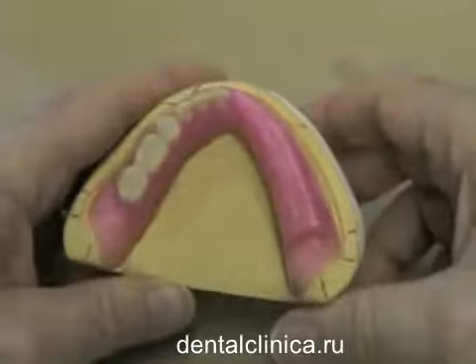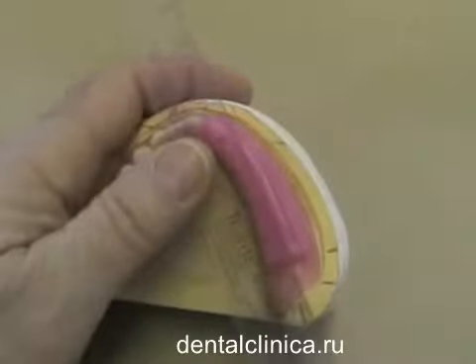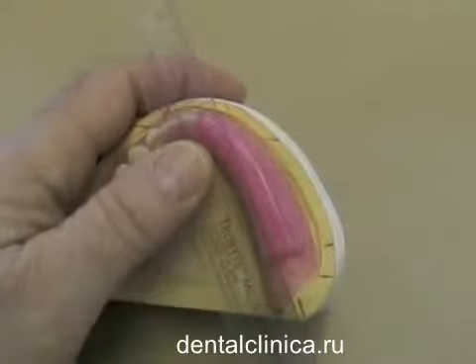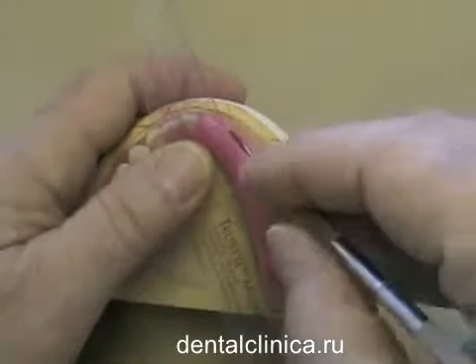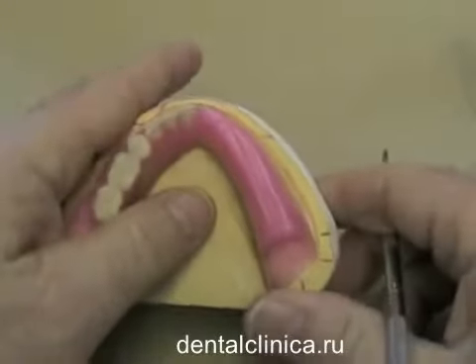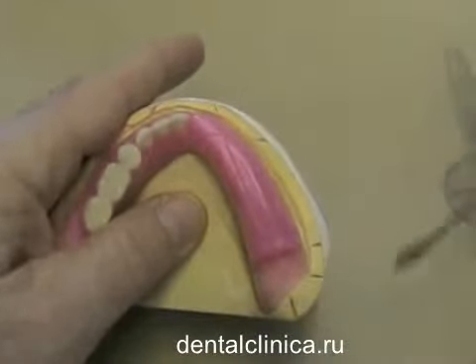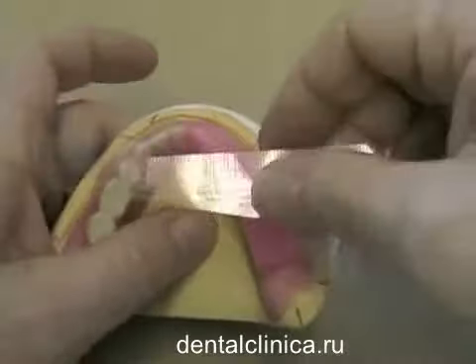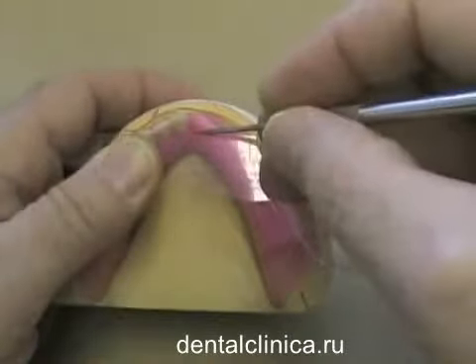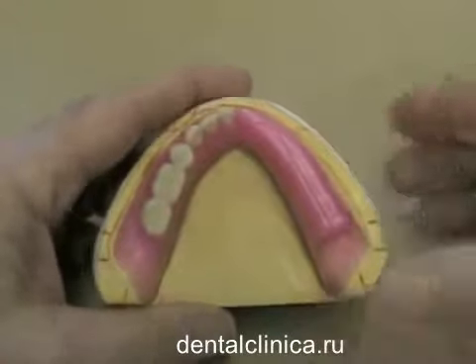Before we actually get to setting the teeth though, it's helpful for us to take our auto rule, line it up with our reference lines on the land area, and actually scribe the line down the middle of the wax rim, so that you can see as we tilt this back and forth there, we now have a nice line in the wax that shows us where exactly the center of the ridge is. The same thing can be done with the anterior reference line that we've placed, and again we would just scribe that in the wax so that that's visible when we're setting our denture teeth.